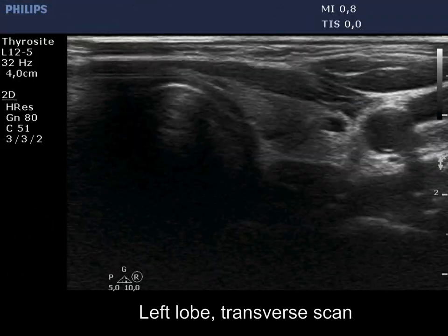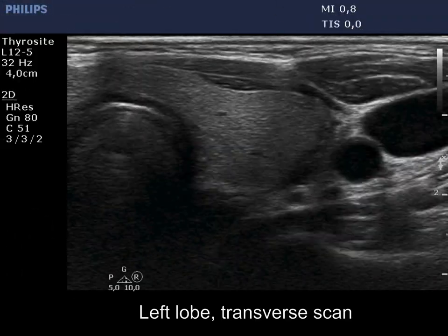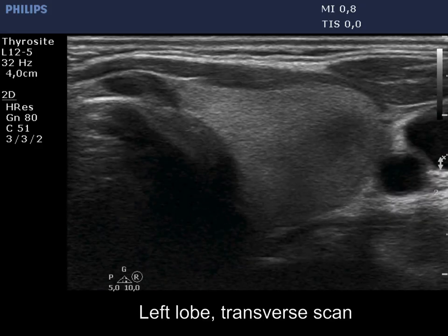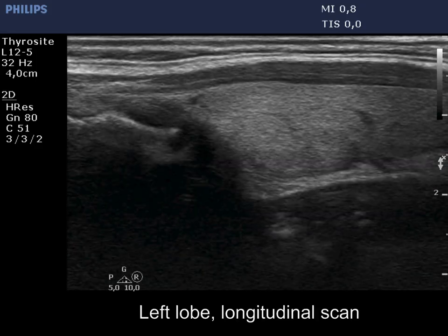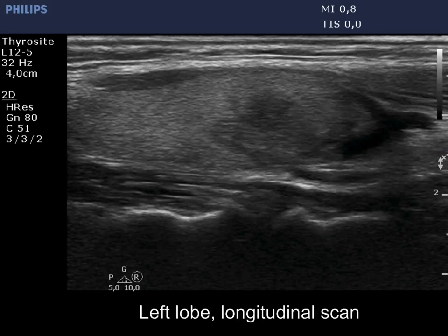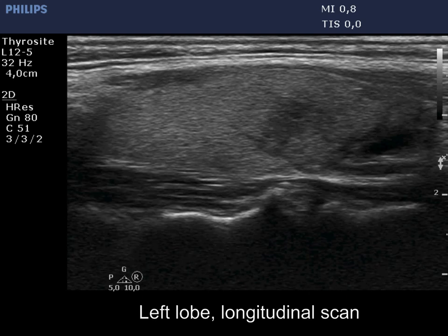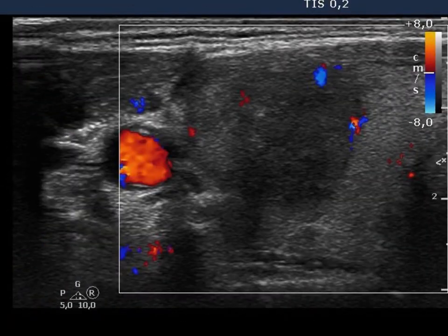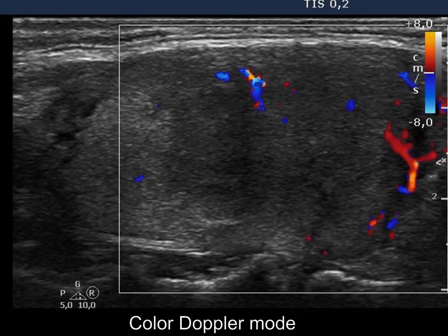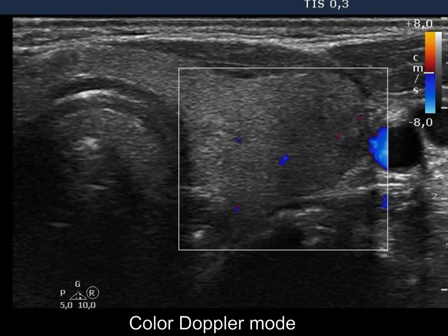The painless left thyroid was echonormal and presented a small hypoechoic region with the pathognomonic blurred borders. The vascularization was decreased both in the right and in the left lobe.